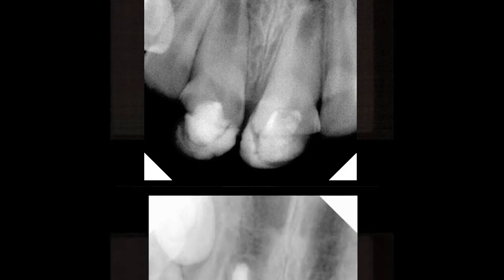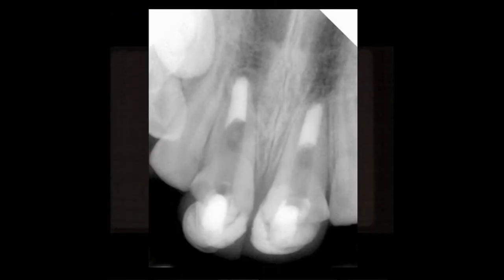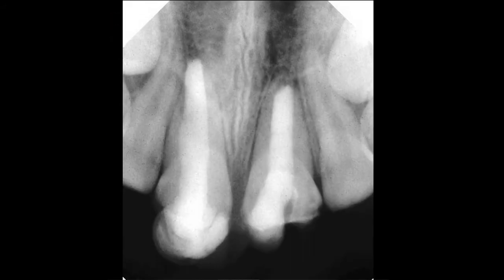Once these teeth are cleansed in a routine endodontic manner, the apices are then filled with a plug of 4 to 5 millimeters of depth of ProRoot MTA. The remainder of the canal is then bonded with a bonded composite. Here is the completed procedure on these two cases.